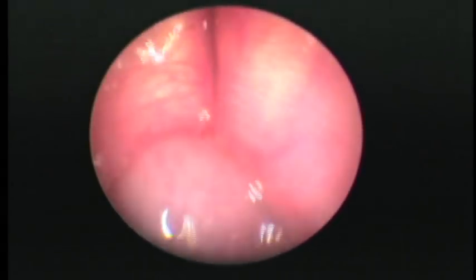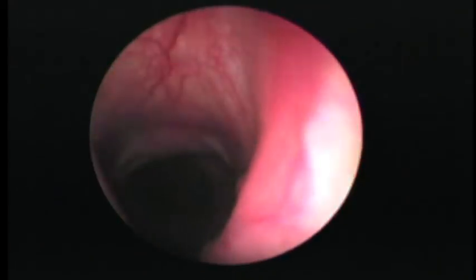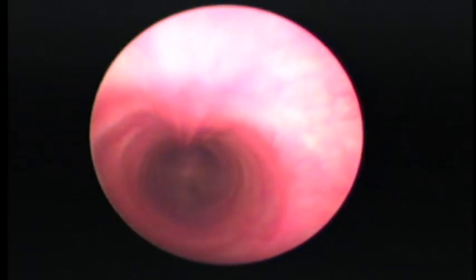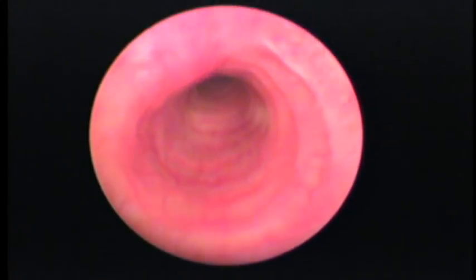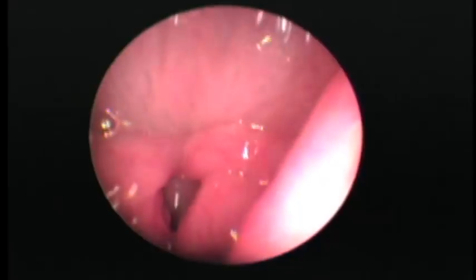When we do these dogs and we're doing surgery, we first go in and examine the saccules. Then we do a tracheal exam because some of these dogs supposedly have tracheal collapse. I do not see tracheal collapse in this dog — we see a really nice tracheal muscle and very normal tissue. I will manipulate the trachea to see if it collapses while we're looking at it.